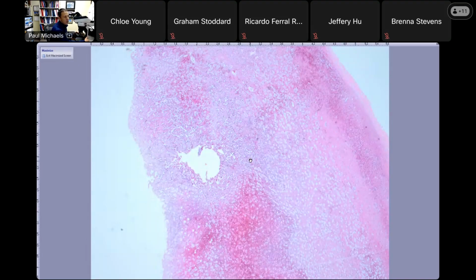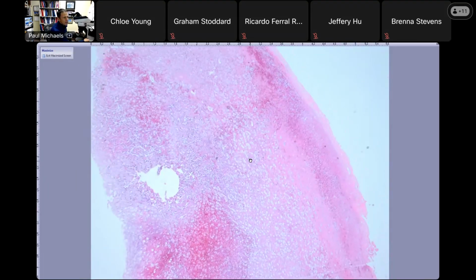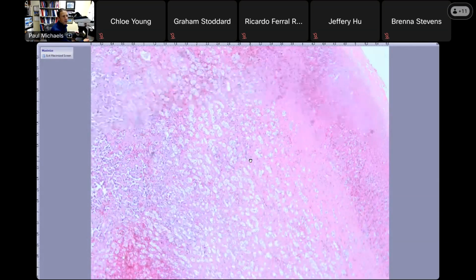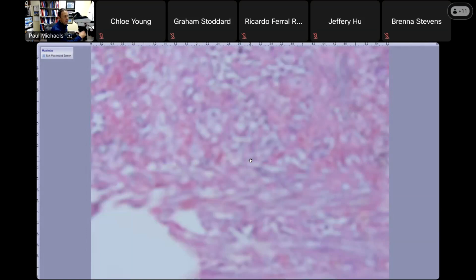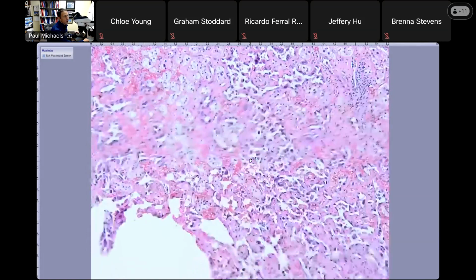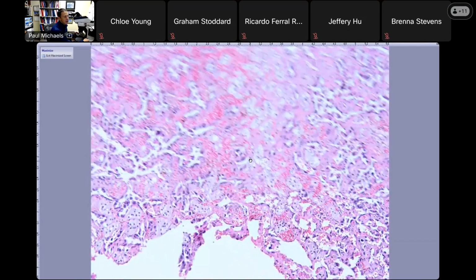Now here's another one that I saw when I was in residency. So again, this is an adrenal gland. When tumors spread to the adrenal gland from somewhere else, like from the bone or soft tissue, they usually go to the surface. But when angiosarcomas occur in endocrine organs, they usually are within the parenchyma. And this one you can see has a really classic vasoformative growth pattern.